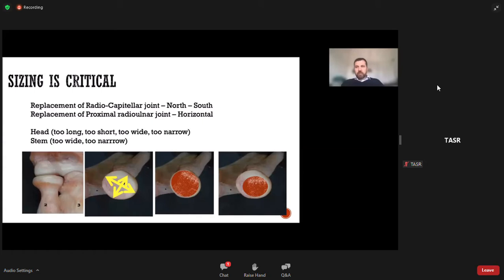And then there is an inner portion that you can nicely draw over the radial head, the one that is articulating with the capitellum. The radial head prosthesis is a circle by definition, so it is something in between these two measures: the wider diameter of the sigmoid portion and the diameter of the inner circle that is going to articulate with the humerus.